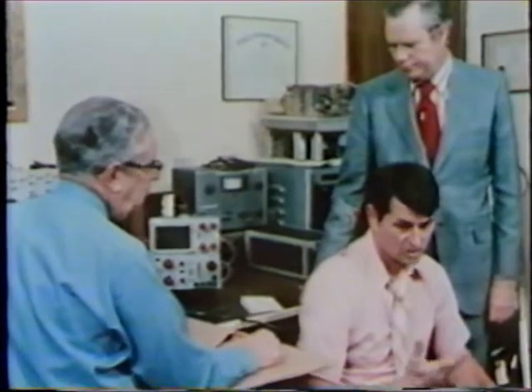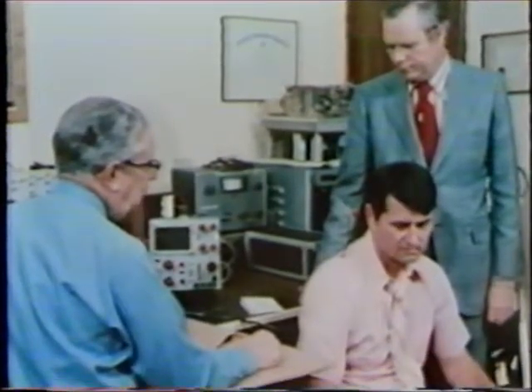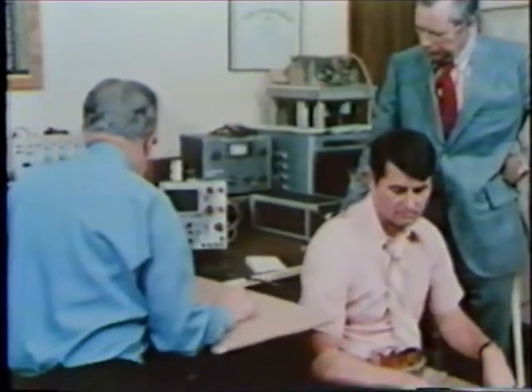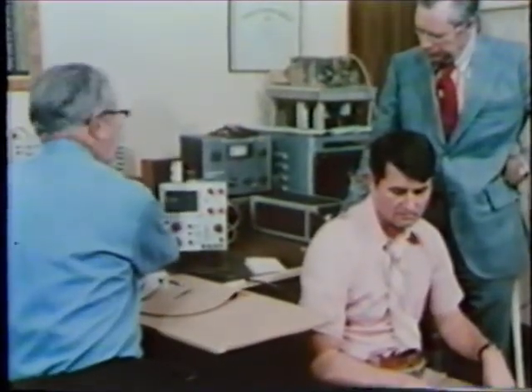As the months wore on, there was no evidence of implant rejection, and we felt that the materials now being used had overcome the problem that caused rejection 9 years earlier.